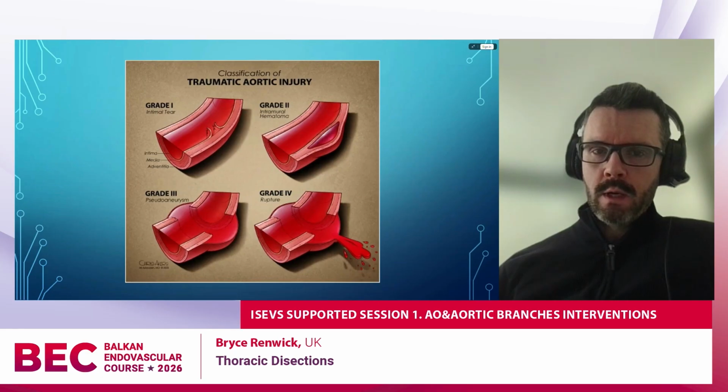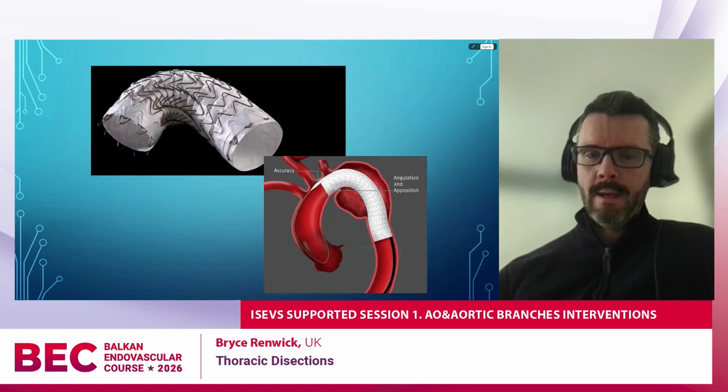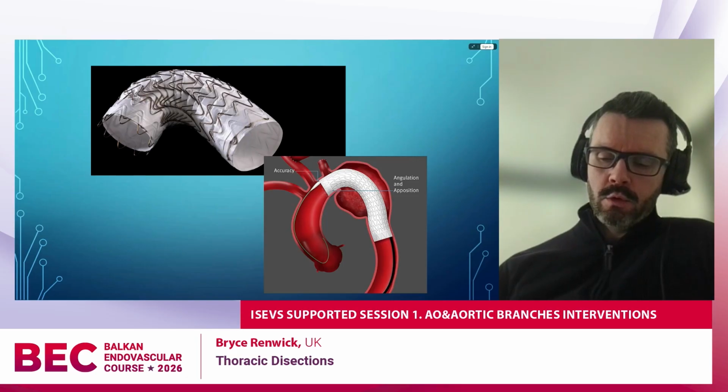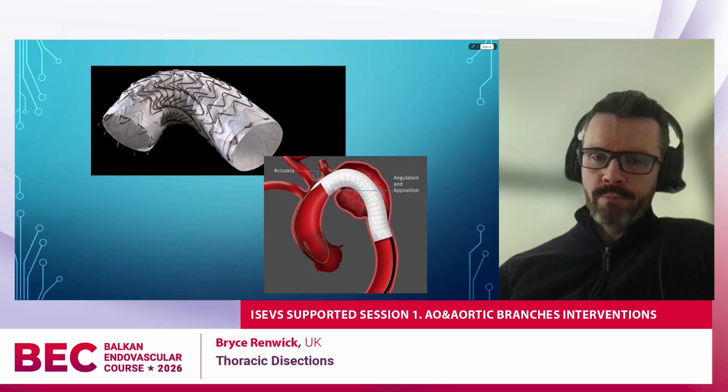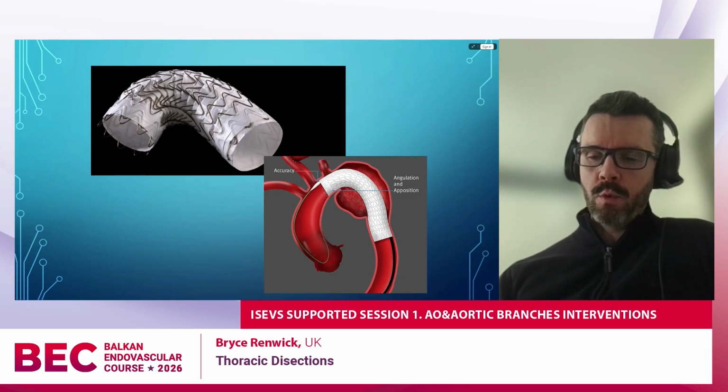Now, the problem with descending thoracic blunt injury is it is a high energy process and is associated with other injuries. So the placement of the stent graft itself is not a big undertaking. Now that we're all used to putting in stent grafts, they work very well and they're very well tolerated. Again, this is the Gore device that we use. They go in very rapidly and we can really rely on them. But the intricacy and the complexity and the case planning problems come when there are significant other injuries, which often happen in high-speed motor vehicle trauma.